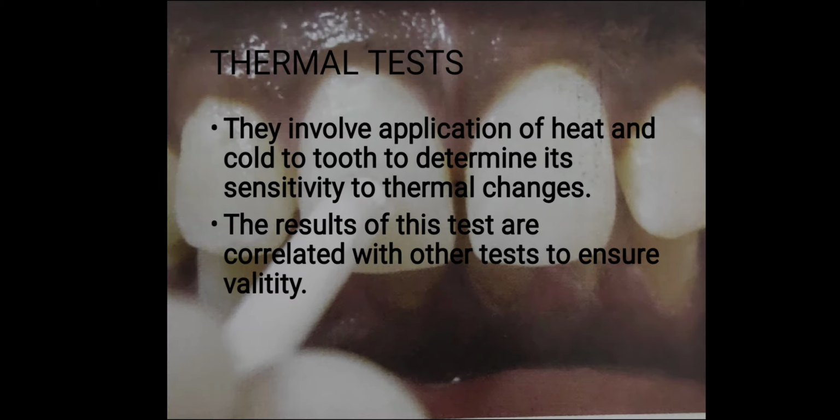They involve application of heat or cold to the tooth to determine its sensitivity to thermal changes. So obviously it is of two types, heat test and cold test. The results of these tests are however correlated with other tests to ensure validity.